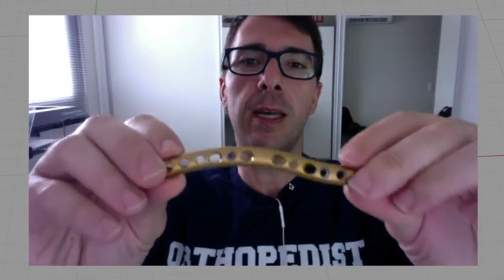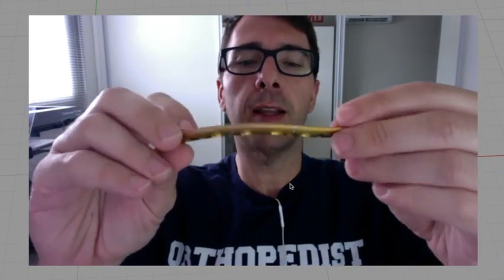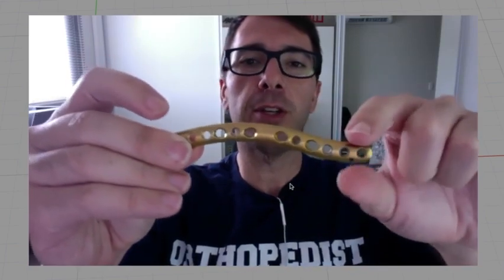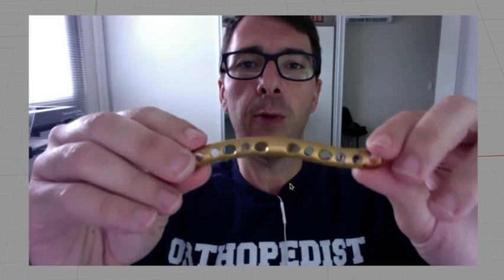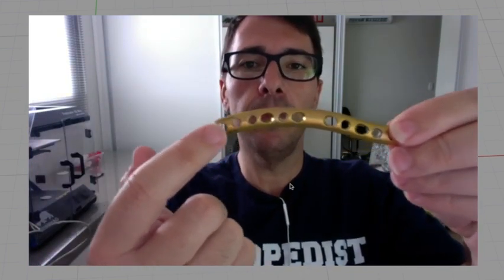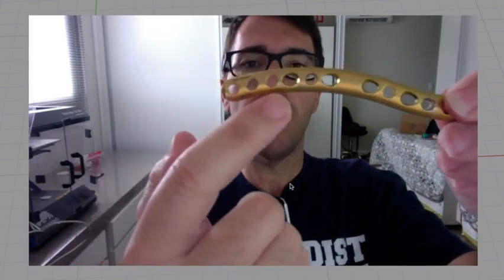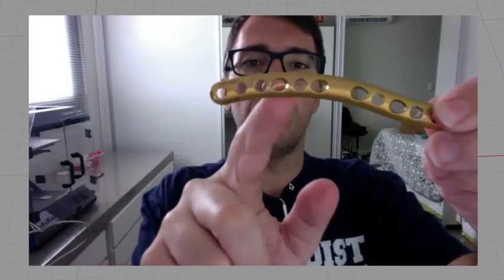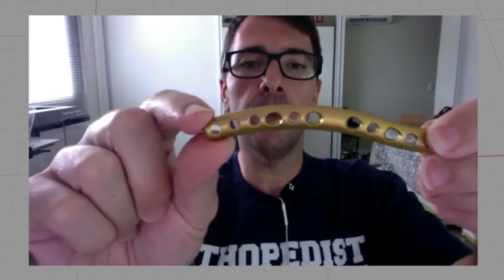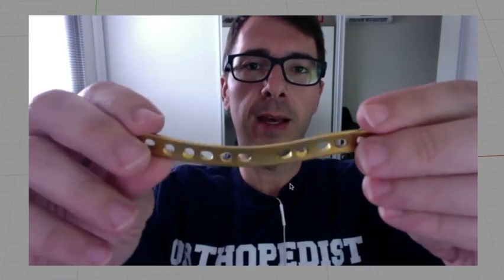So this is a titanium locked plate for the clavicle. Here we can see it's S-shaped, just like the clavicle. And here we have two types of screws. We have the locked screw, shown here, and we have the cortical screw. So we have two different types of screws in this implant. We are going to learn how to draw this implant in order to plan our surgeries.